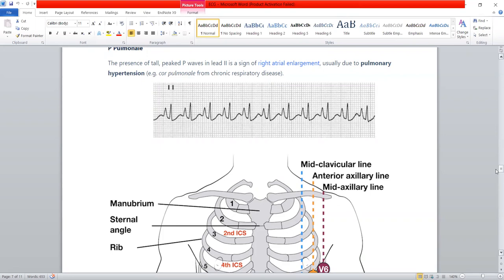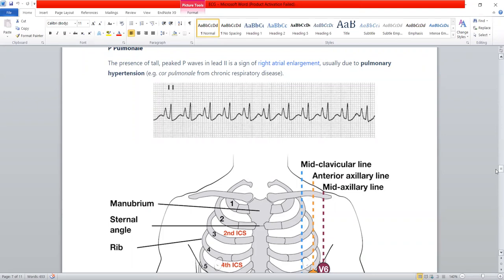If the PR interval is shortened, the condition is Wolff-Parkinson-White syndrome. The clinchers for Wolff-Parkinson-White syndrome on ECG are a shortened PR interval and a delta wave. A delta wave is an upward slant of the initial portion of the QRS complex. So a shortened PR interval plus a delta wave on ECG makes the diagnosis of Wolff-Parkinson-White syndrome.